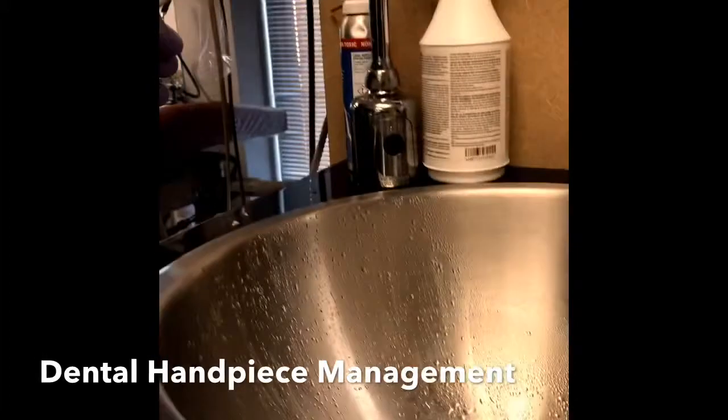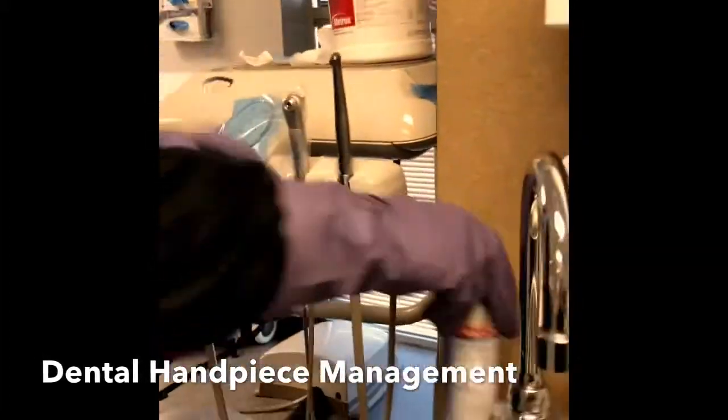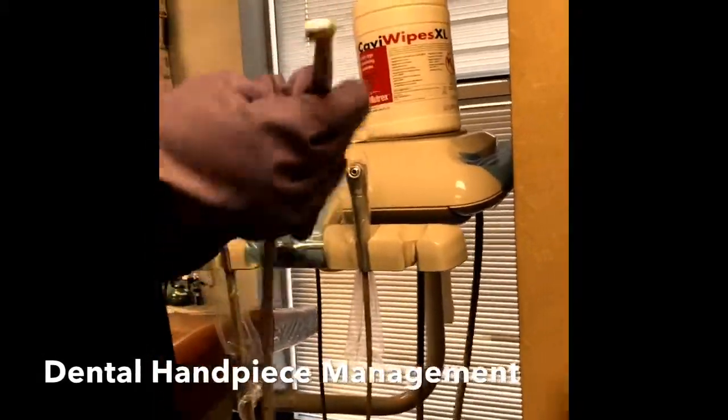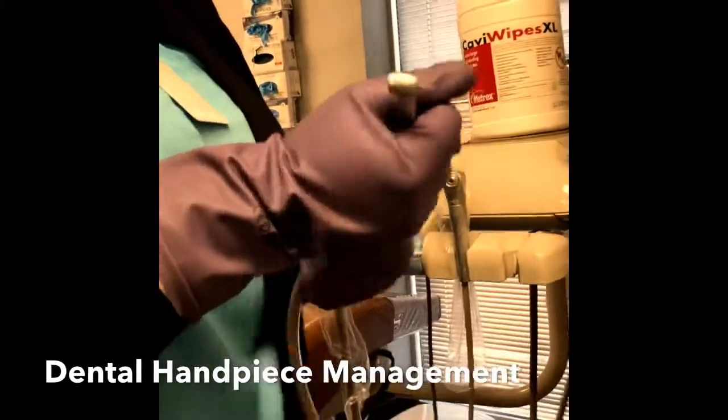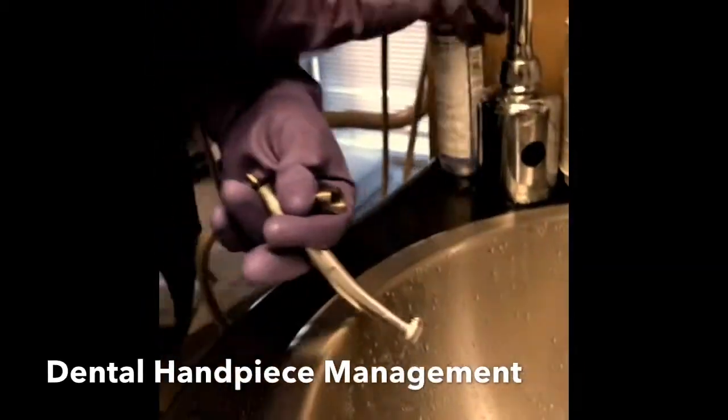And now we are running our handpieces. As you can see, Samantha has the Cavicide wipes and our lubricant. We're going to start by disinfecting the handpiece with our Cavicide wipes by wiping all around it, and then she's going to go ahead and lubricate it so she could let it run for at least 15 to 30 seconds.